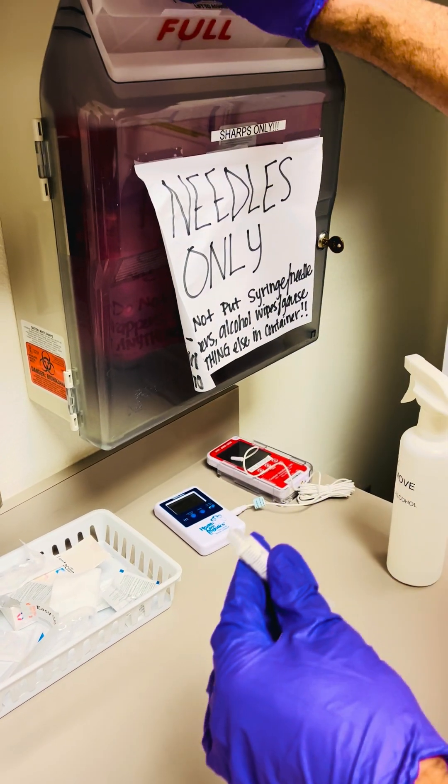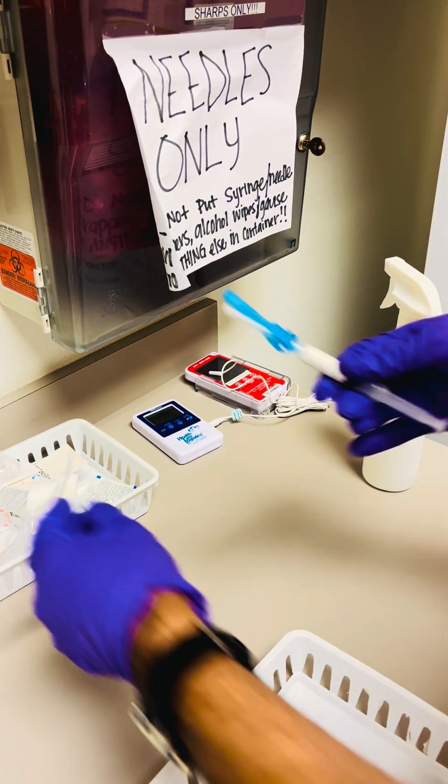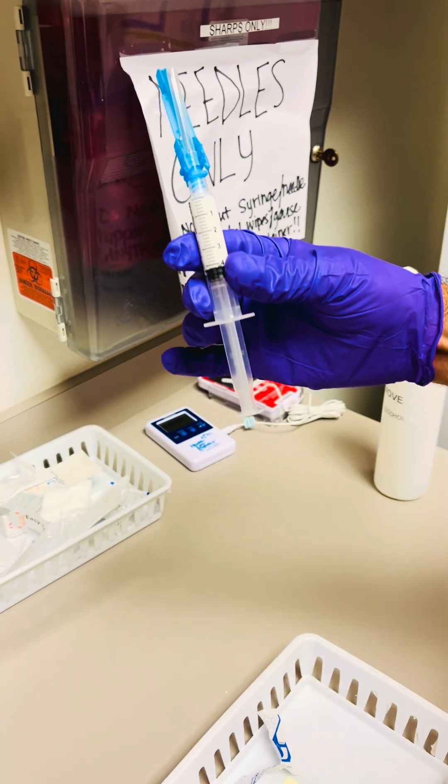Cap the needle and replace with the 23 gauge needle in preparation for administration. And that's it.